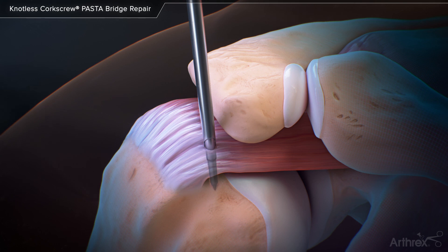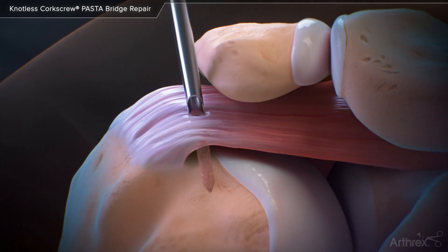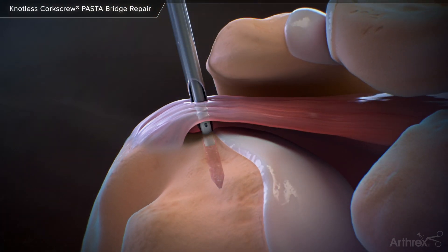Prepare the bone socket using the knotless corkscrew punch and then insert the partially threaded anchor by rotating in a clockwise direction.